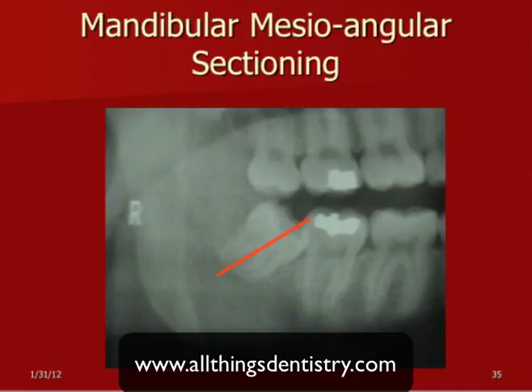One of the things I use is a little 15 scaler. I scrape off all the periodontal ligament around it, get a good view of the crown, so I know where the buccal groove's going, and then I can estimate where the furca is, and then I start on about the mesial cusp and then angle down toward that. Sometimes you have to do it blind because the furca is so far down in there, you have to remove a tremendous amount of bone to actually visualize it. Other times I'll actually get down there with a scaler and slip it down there. A little 15 scaler, it's a real small little scaler. I use that a lot. I use it almost like my sixth finger. You can slide it down in the PDL there and you kind of feel where the furca is. So that's another little tip.